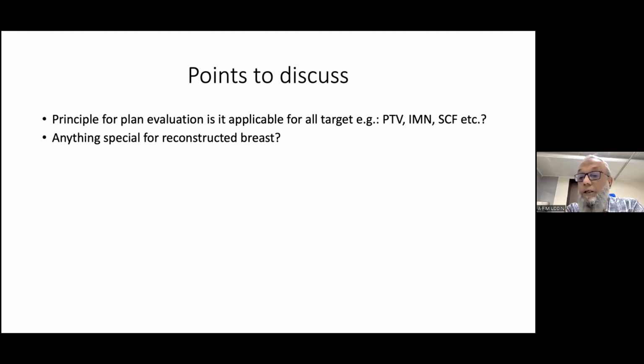Again, I look at the location of the tumor, what the tumor burden and nodal burden were, all these things. What is the age of the patient, what are the comorbidities? By this, we make a trade-off between the OAR dose, especially here, the heart dose is the issue. Sometimes lung dose is also an issue. So these are guidelines, these are set rules, but this is not a Bible. We clinicians must understand the strengths and weaknesses of all these limitations, and then we should proceed.